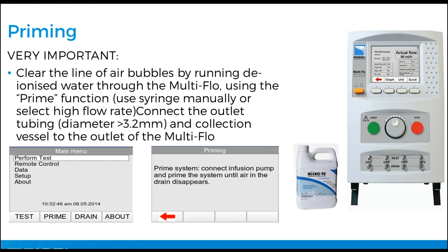One thing that is good for maintenance is using something called a Micro 90 solution. And we have a maintenance guide on our website to give the guidance of performance and how you should use this Micro 90 solution. Effectively, what it does is it's like a wetting agent almost. You put a really small concentration in. For typical PPMs you would keep your multi-flow well maintained, but also every month you could put through a higher concentration. The guidance, again, is on our website, and it will clean out each channel.